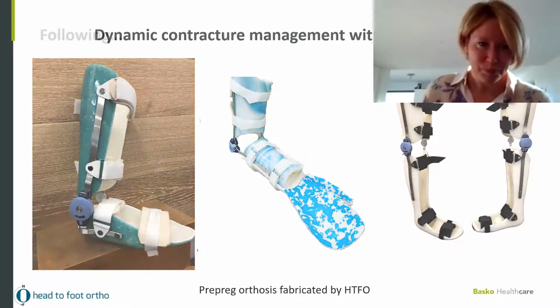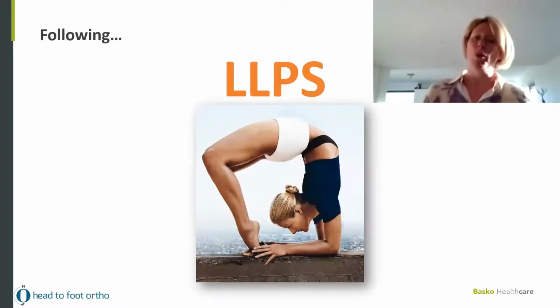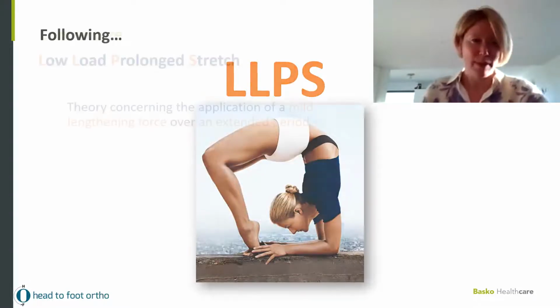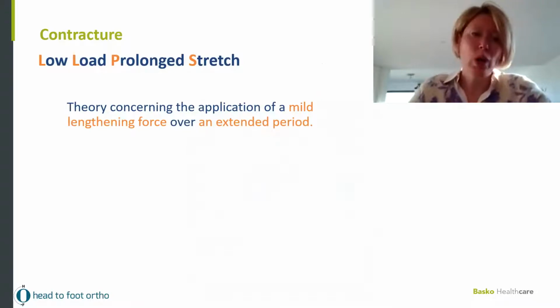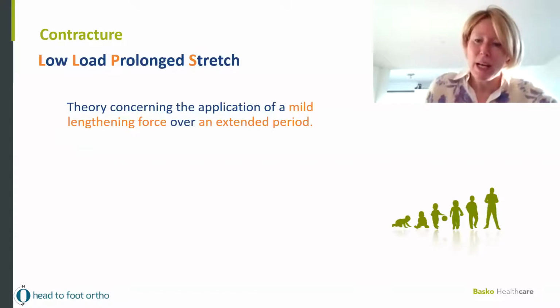So we will do dynamic contracture management following, of course, LLPS. LLPS stands for low load prolonged stretch. It's a theory concerning the application of a mild lengthening force over an extended period of time. So we will apply that force.